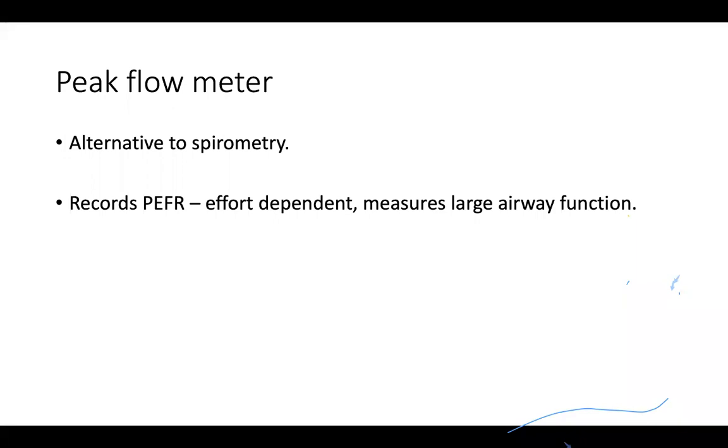Also, apart from spirometry, even lung volumes, since we already said that residual volume is not measured by spirometry, in these cases we have to do plethysmography or gas dilution. Plethysmography works on Boyle's law, where P1 V1 equals P2 V2, so depending on the changes in pressures, you can determine the volumes. And gas dilution methods are computer calibrated, and they measure how much gas is present.